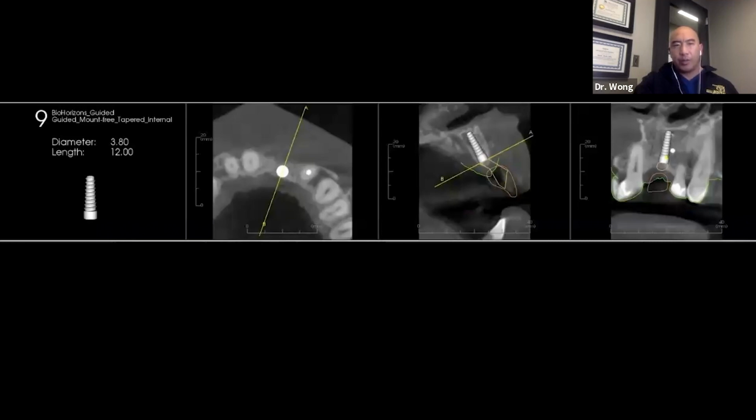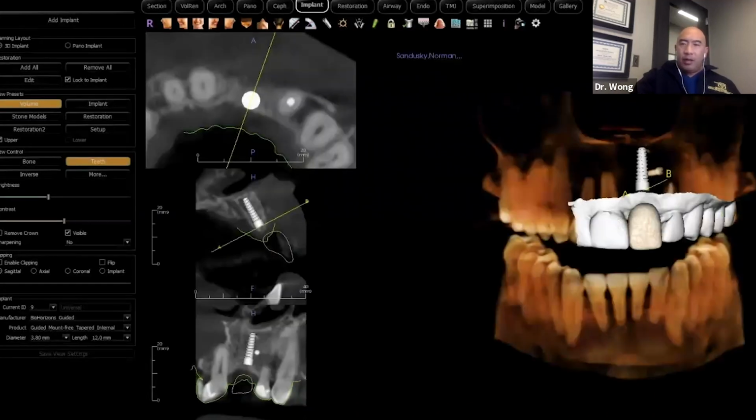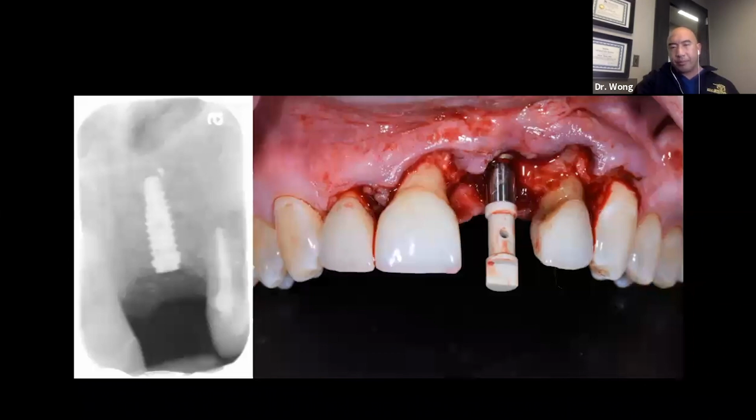So here's our surgical guide planning. This is with Bio Horizons once again. So implants in place. You can see the proposed implant position, mostly in the center of your screen here. We have the provisional already kind of sketched out as well. So the implant goes in.